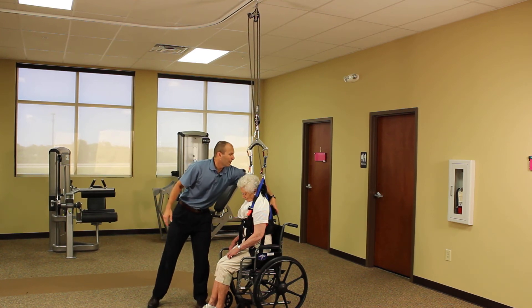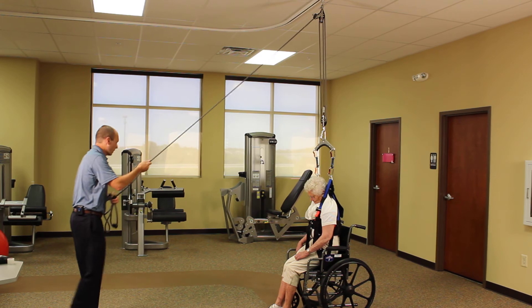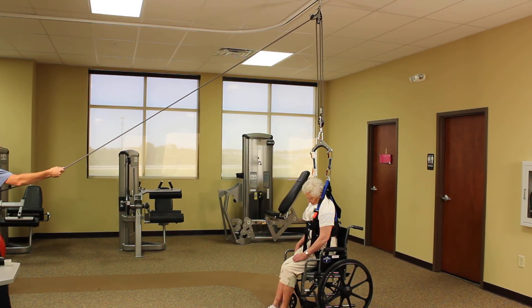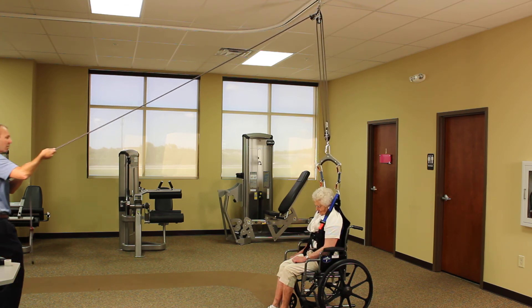We're going to take the rope out of the rope bag. We're going to step as far away as we can from the patient, being prepared to accept their weight, lift up on the rope to take it out of the cam cleat, and lower them into the chair.